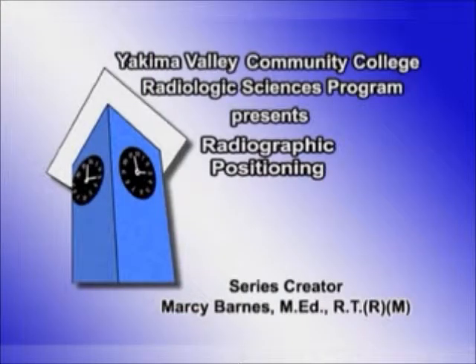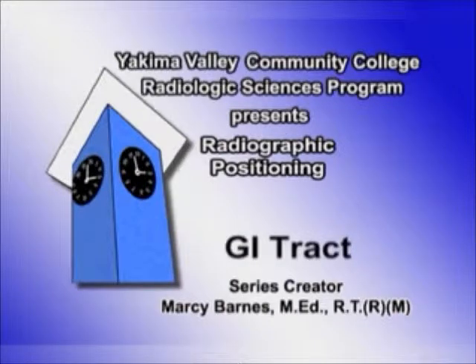Yakima Valley Community College Radiologic Sciences Program presents Radiographic Positioning, GI Tract. We're going to spend this session focusing on the alimentary canal. The alimentary canal is the GI tract from mouth to anus.